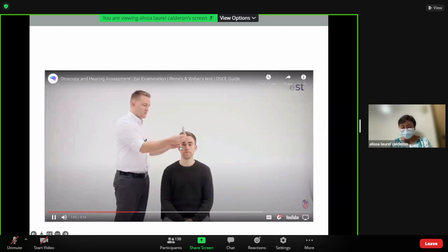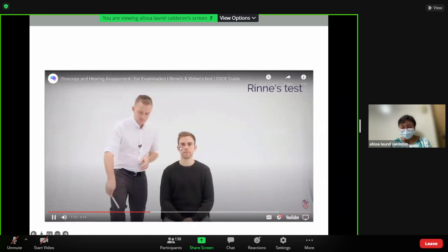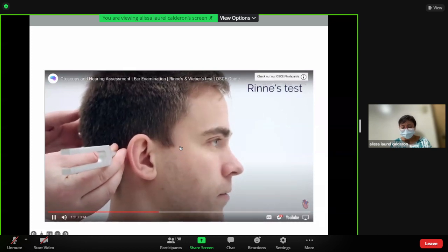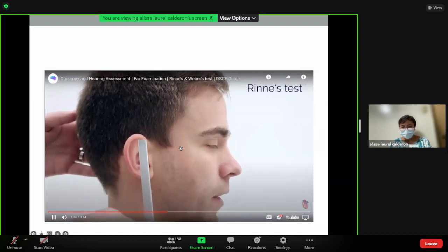It's in the middle. I'm now going to place this tuning fork on the bone behind your ear. I'd like you to let me know when you can no longer hear the sound. I can hear that. And it stopped. Can you hear it now? I can.